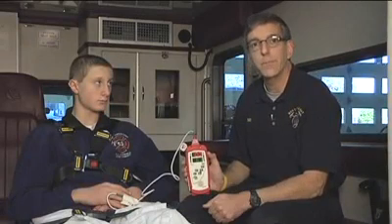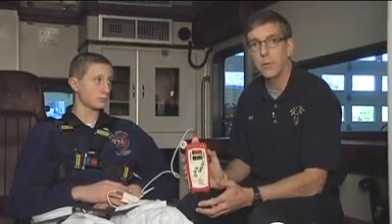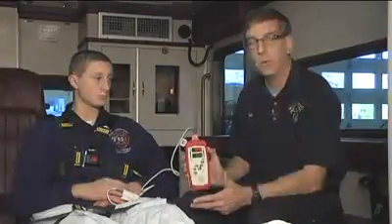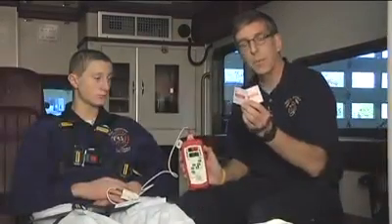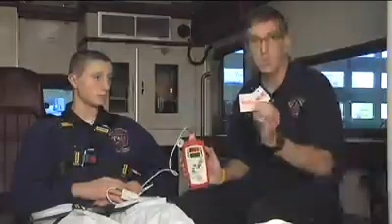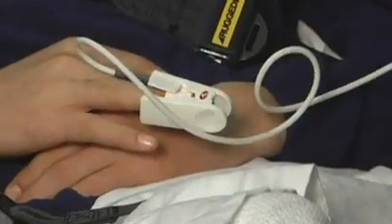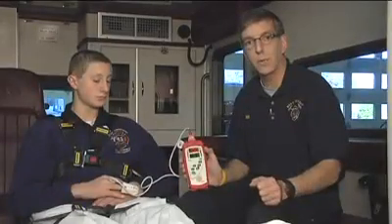The other question is nail polish. Can nail polish interfere with pulse oximetry? In fact, three colors of nail polish actually do throw the signal off: black, blue, and green. So if your patient is wearing nail polish, you may use a nail polish remover — a prep pad similar to an alcohol pad with acetone on it — to wipe the nail polish off the patient's nail. You could also position the probe so that it reads sideways through the finger, avoiding the nail bed completely, which would eliminate the effect of black, blue, or green nail polish.